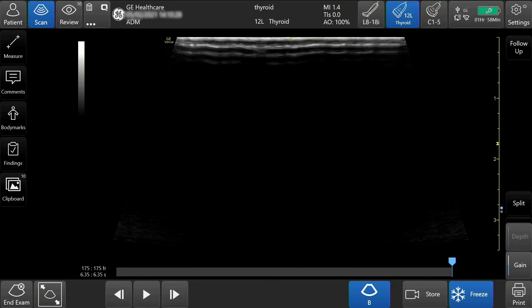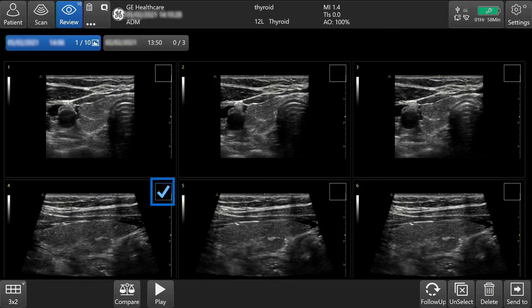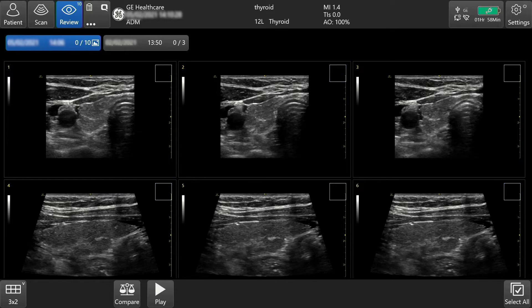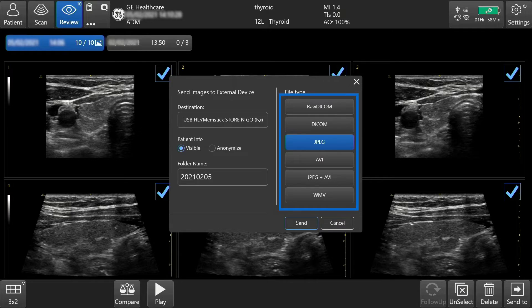Or, you can send images to an external device by tapping Review in the upper left-hand side of the screen. Tap the images you would like to send, or press Select All in the lower right-hand corner to highlight all images. Tap Send To and select your destination. If desired, you can anonymize the patient here.